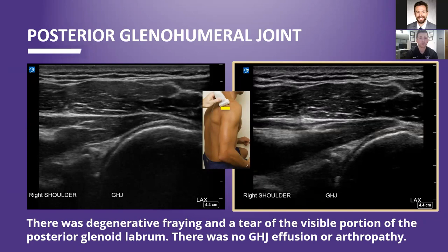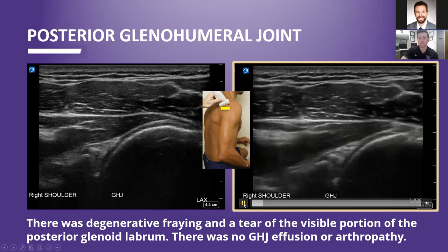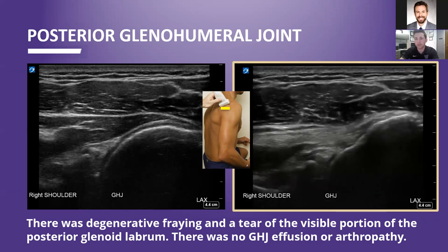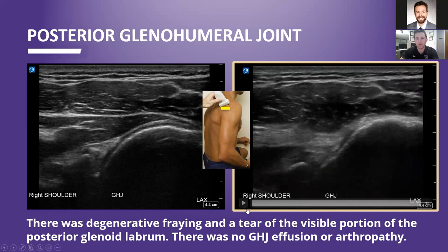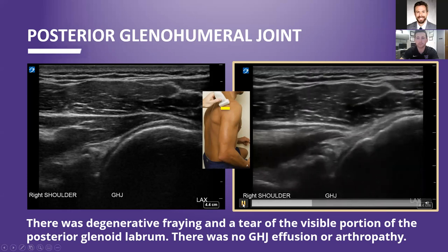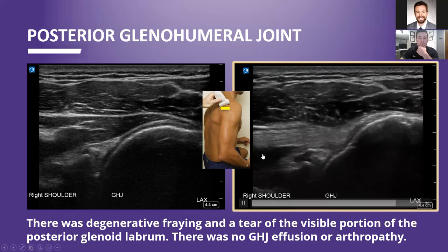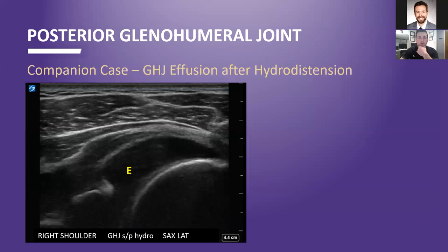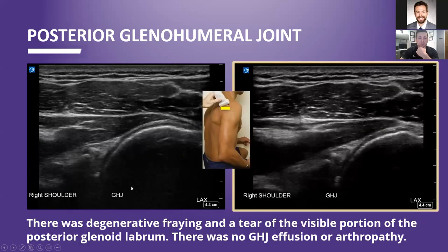Focusing on the posterior glenohumeral joint: there was some degenerative fraying of the labrum and there was a tear at the posterior aspect. There wasn't any glenohumeral joint effusion or arthropathy, and this patient was relatively young, so that made sense. You can see the labrum move a little bit more than you'll see on normal labrums when this patient goes into external rotation. Just to give an example of an effusion — this is a different case after hydrodistension — it helps show where you're going to see a glenohumeral joint effusion and confirms the lack of any effusion here.